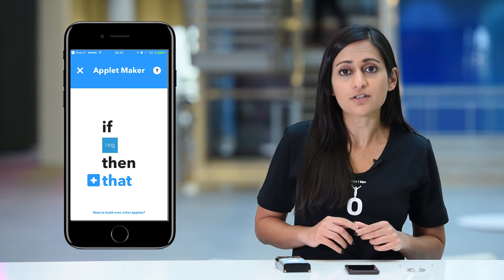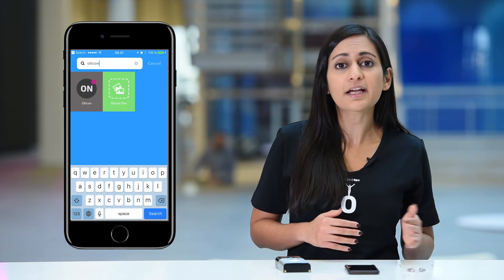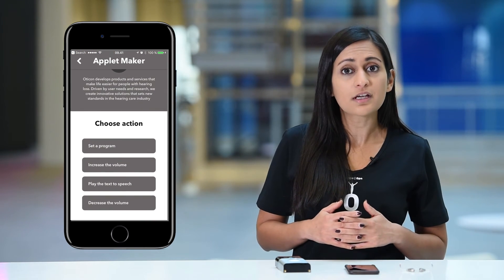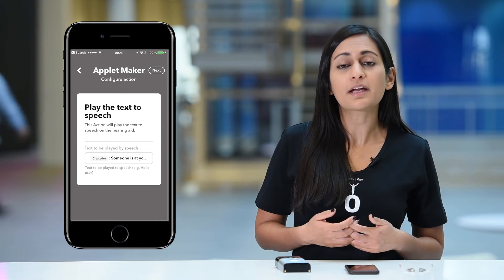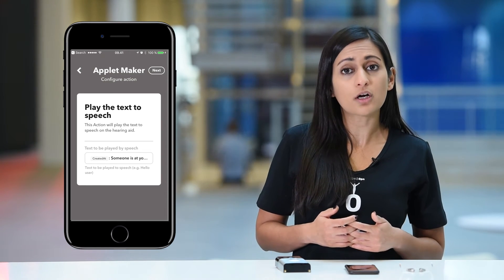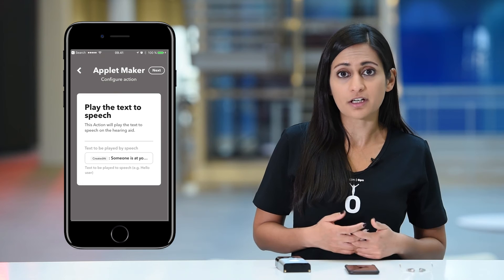Tap the plus sign to do that. Search for Oticon and specify the action you want. In this example, I'll select Play Text to Speech. If this is the first time you create an applet with the Oticon Open device, the IFTTT system needs to know how to connect to your Oticon account. Simply tap Continue and enter the account information you used when creating the Oticon account. This way, IFTTT is allowed to contact the Oticon app and send spoken notifications to your hearing aids. You only have to do this once to establish a connection.